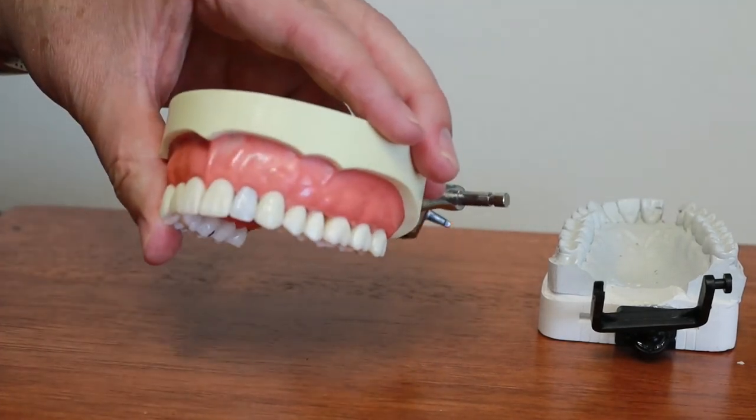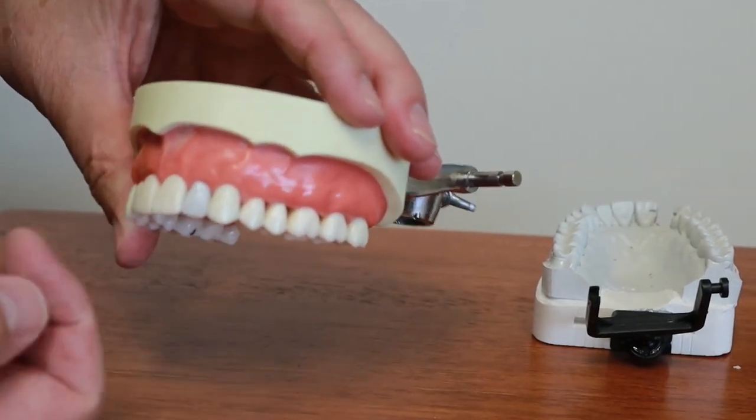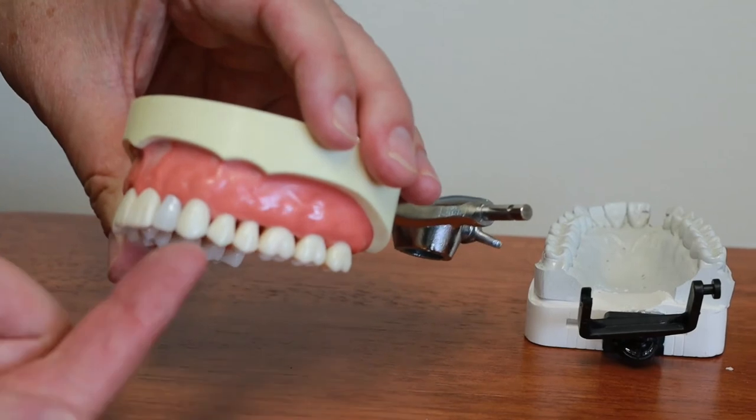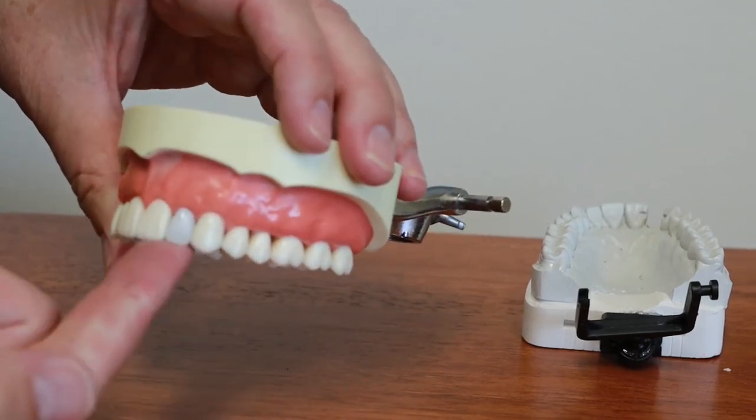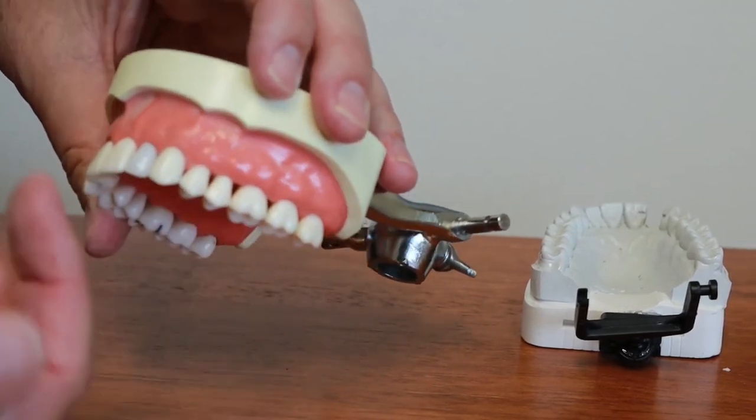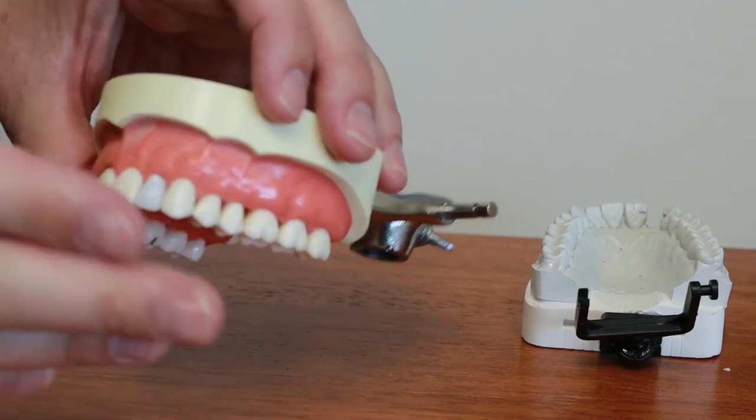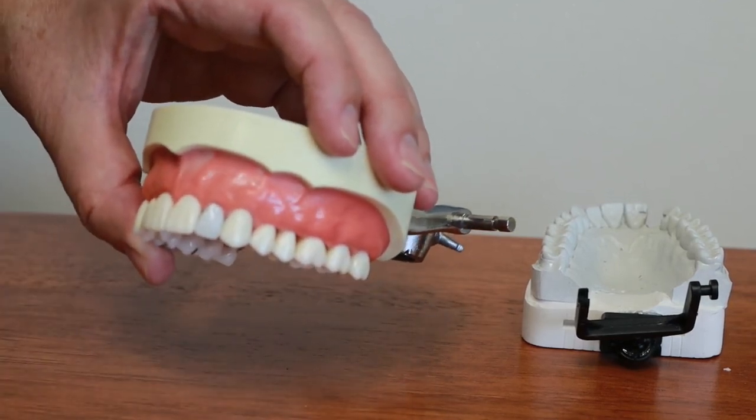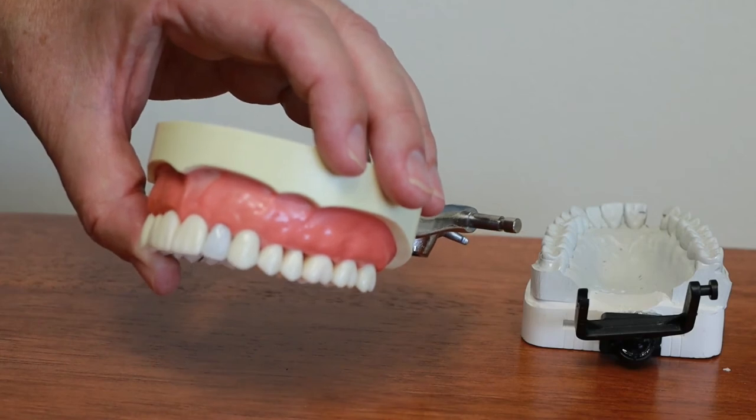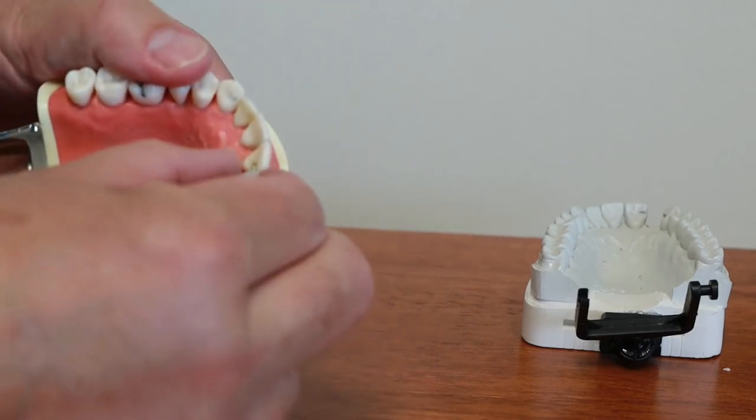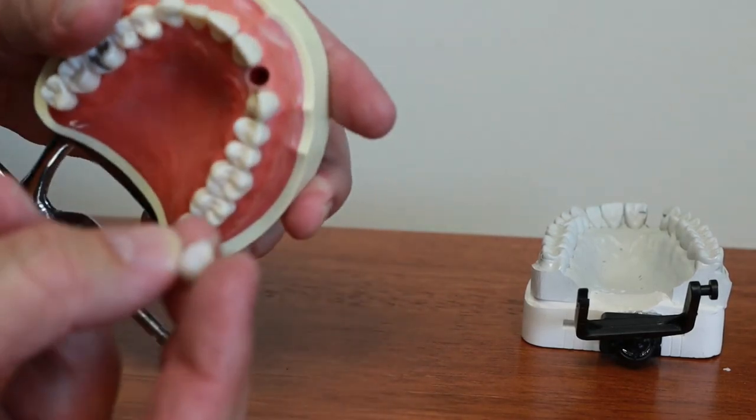At this point in time I'll give the patient a mirror. I'll set the patient up, give them a mirror, have them double check, make sure we pick the right color. They like the shape, they like how everything looks. Because if you need to change anything now's the time to do it. Once the patient gives us the go-ahead that's all good, now we're ready to bond.